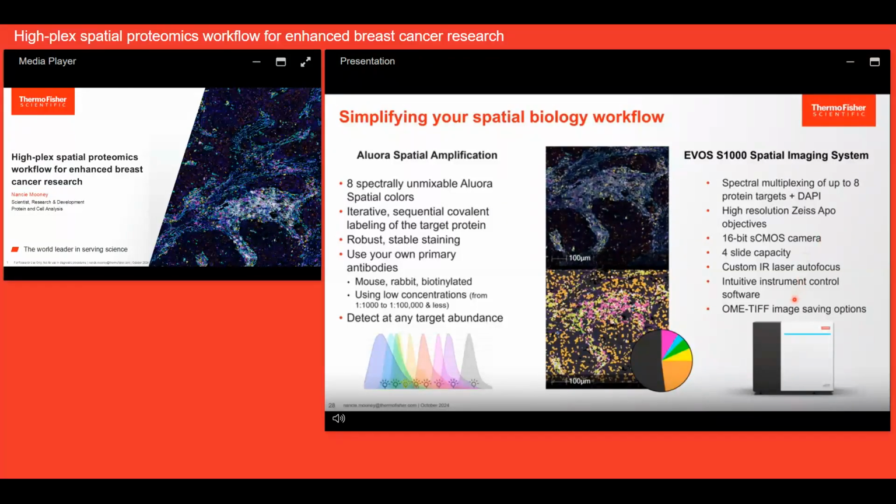These were then produced as OME-TIFF that I could feed into a data analysis program, enabling me to do cellular phenotyping and other data analysis, all the while using intuitive instrument controls to make getting these images very easy. So hopefully this webinar was very helpful.